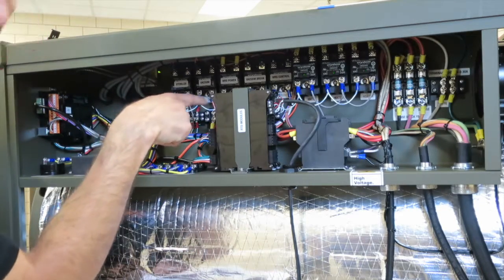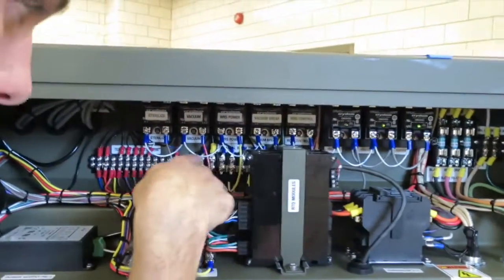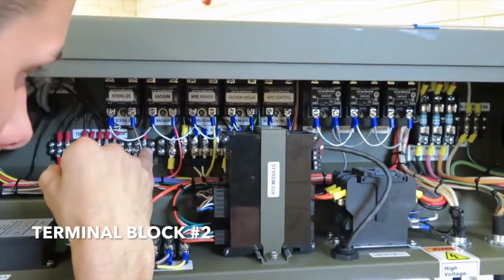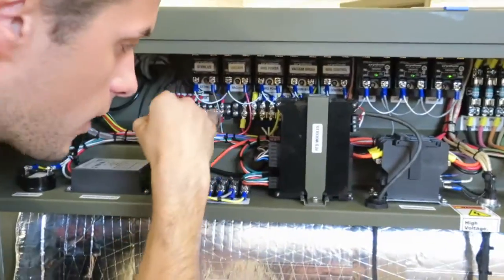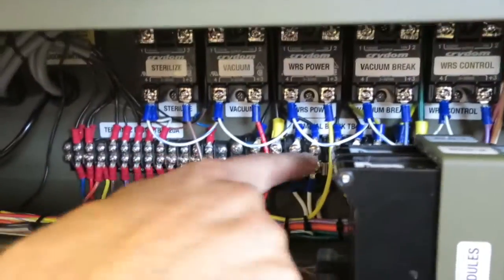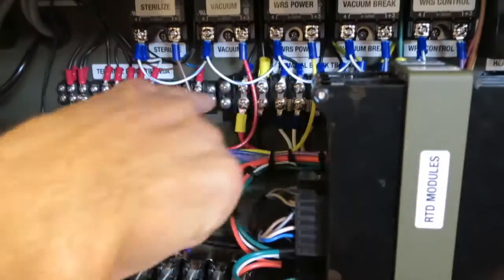Right here in the back, it's kind of hard to see, we have terminal block number 2. You'll see we have a lot of 120 volts. Across the bottom we have some of the neutrals, some of the grounds. But that is fuse block number 2 right there. Sorry, that's terminal block number 2.